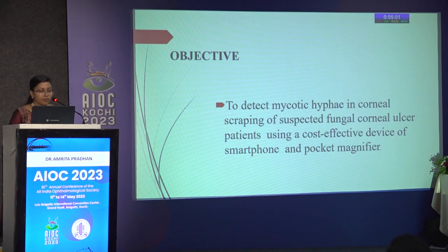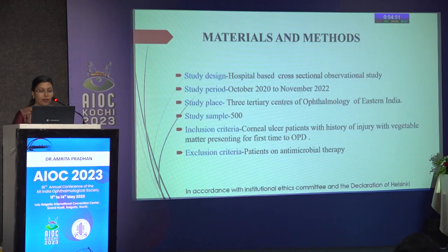So our objective was to detect mycotic hyphae in corneal scraping of suspected fungal corneal ulcer patients using a cost-effective device of smartphone and pocket magnifier. It was a hospital-based cross-sectional observational study. Study period was from October 2020 to November 2022. There were three tertiary centers of ophthalmology of Eastern India.